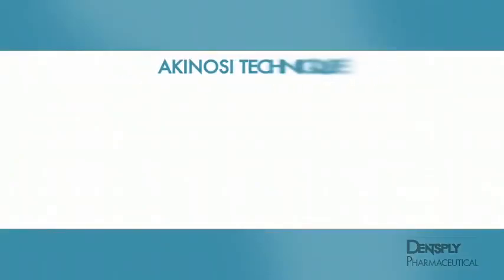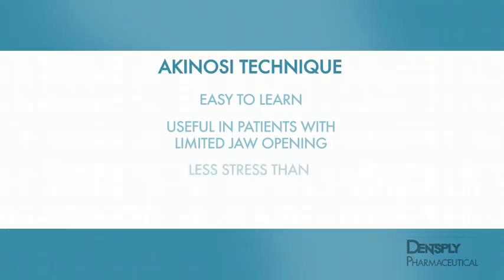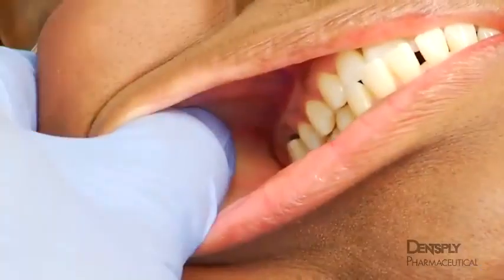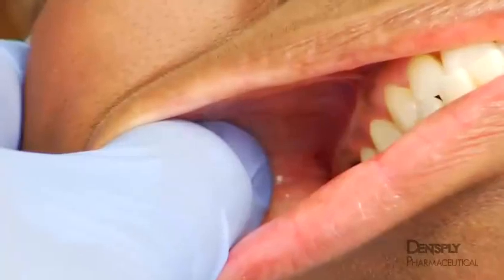Although the closed mouth technique is essentially a blind injection, it is technically easy to learn and of great advantage in the patient with limited jaw opening. It is also perceived by some patients as less stressful than the standard inferior alveolar nerve block, yet comparable in onset time and anesthetic efficacy. When failure does occur, it is usually caused by the needle being angled too medially.